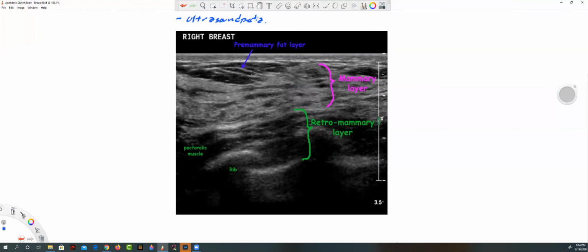But once again, skin, by the way, is around 2 millimeters or less. Fat, of course, is variable. So mammary fat, yep. This mammary layer on this person, look at that, comes all the way up to the skin for a little point right there.